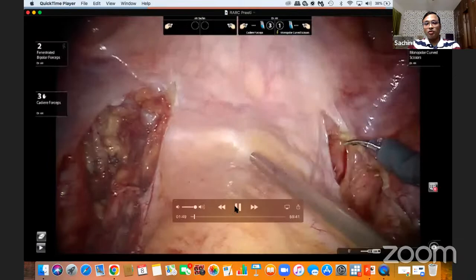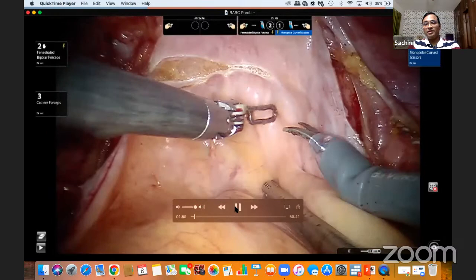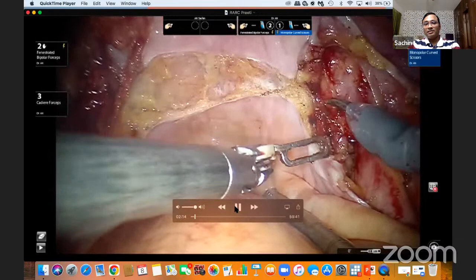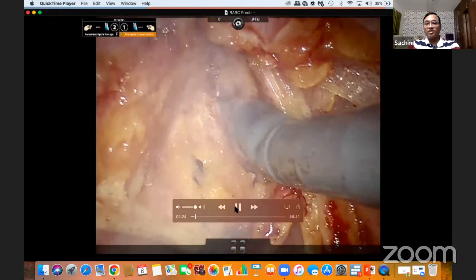We join both the incisions in the cul-de-sac. This incision is given just about 1 to 2 centimeters above the cul-de-sac. The difference between this and radical prostatectomy is that we don't go into the seminal vesicles. We go beneath the seminal vesicles. In the sense, you will be posterior to the seminal vesicles, no? Yes, posterior to the seminal vesicles.